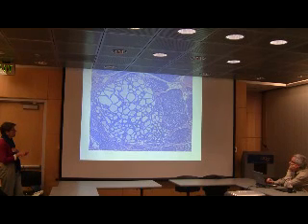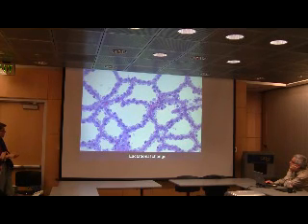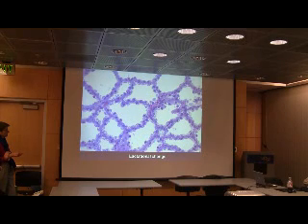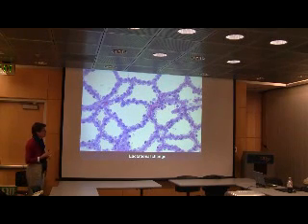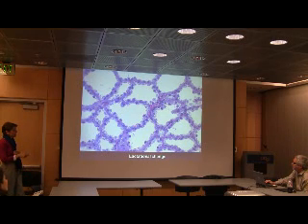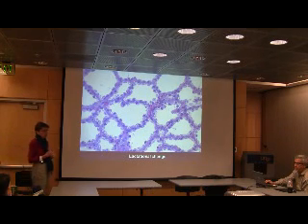And you can see how dilated some of these spaces are. If we go to the next picture, you'll see a high power view of breast epithelium that is secretory, now producing milk, which is released into this space and then transported through the duct system to the nipple. So these cells look very different from the quiescent breast that's not lactating, but this is also a normal picture of benign breast.